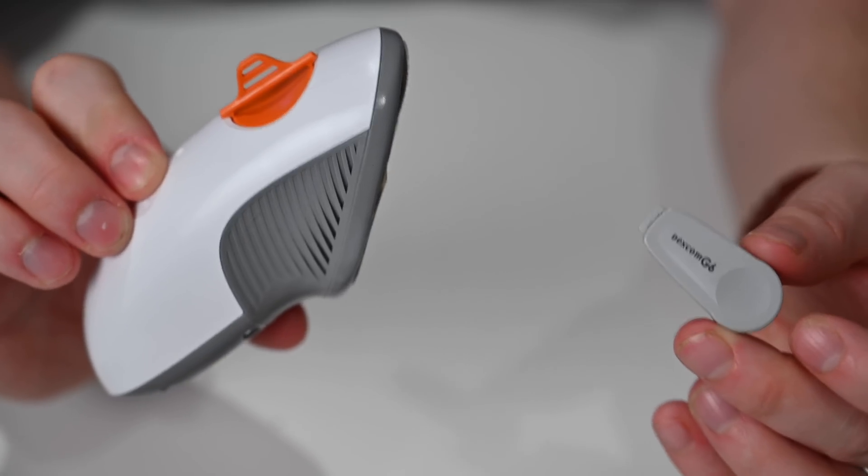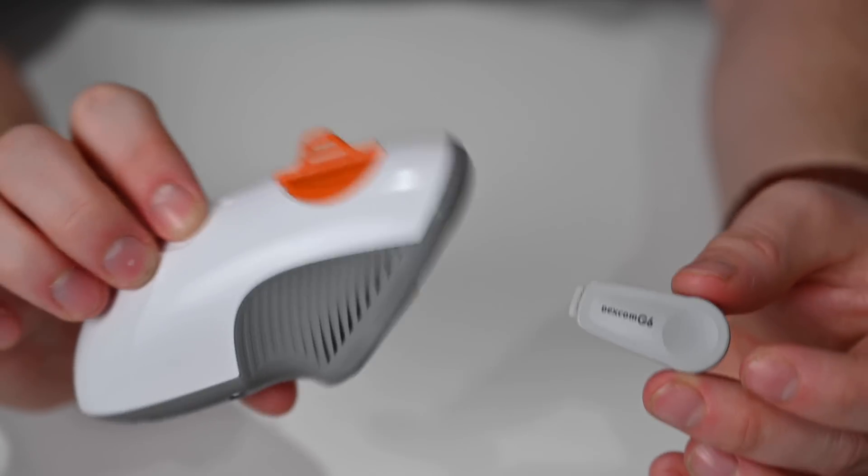Dexcom has now officially allowed the G7 to be placed in more areas. The Dexcom G6 was limited to just the abdomen, though many of us definitely wore them in other places like the back of the arm. The G7 now officially supports behind the arm for ages two and older, and for older users, you can also use the upper part of the butt or lower back. These were common spots people used, but they were not officially supported with the G6.